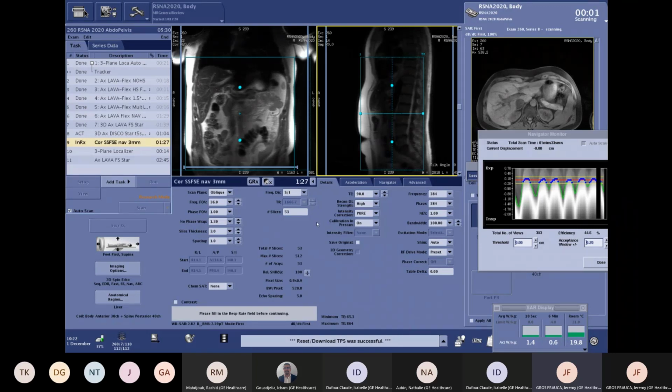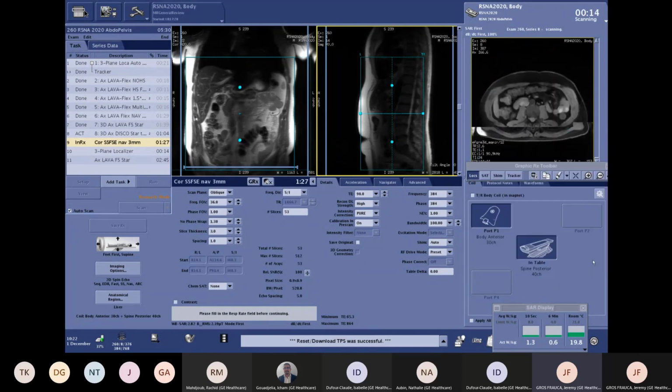This is our last and breakthrough technique we call Recon DL. Recon DL is a deep learning based algorithm for reconstruction, which is working specifically on raw data to detect and remove specifically noise and Gibbs artifacts. So as you may understand, as we are removing noise, we are improving signal noise ratio, and then we are addressing these challenges. And it will be a totally different way to optimize your sequence.